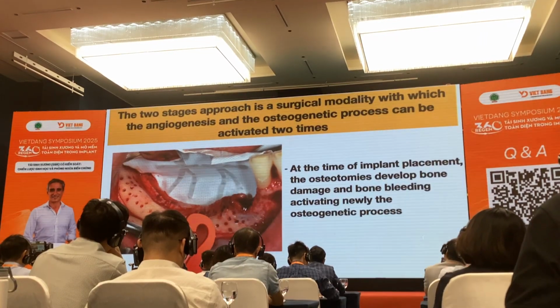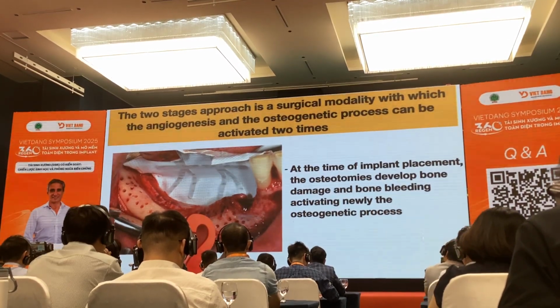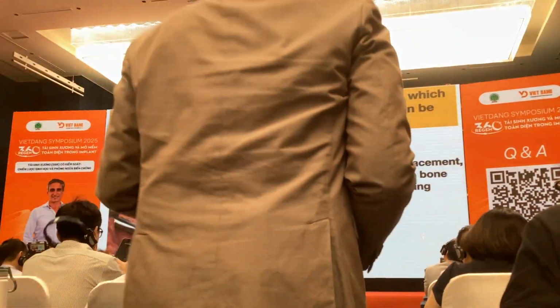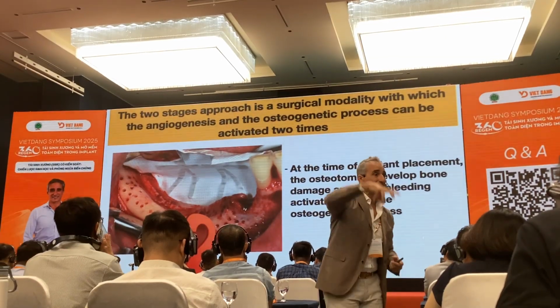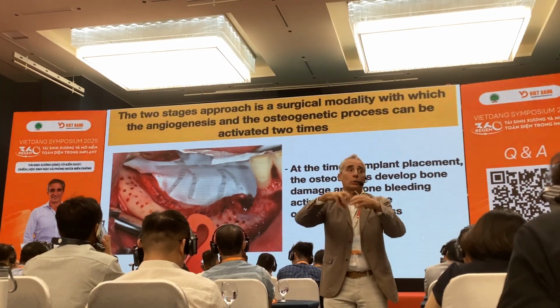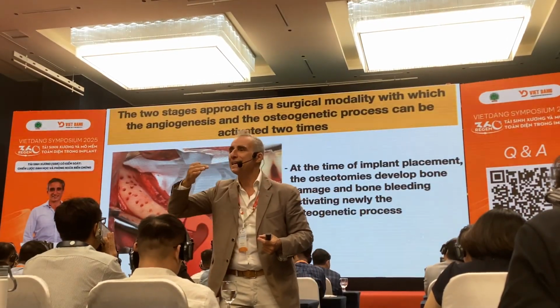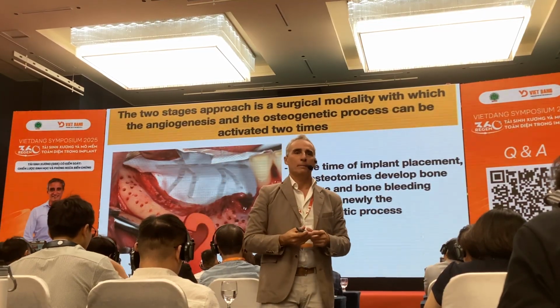And so, at the time of implant placement, I damage the bone again with the osteotomies. And I activate the bleeding again. I damage the vessels, and the vessels are activated in new proliferation. It means that this second stage promotes again a new osteogenetic activity.